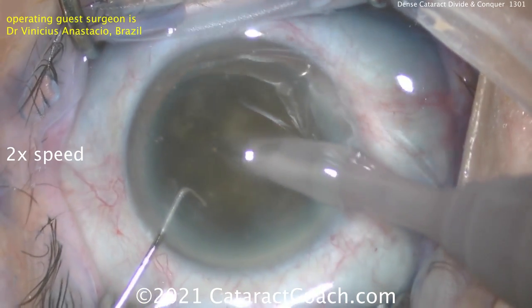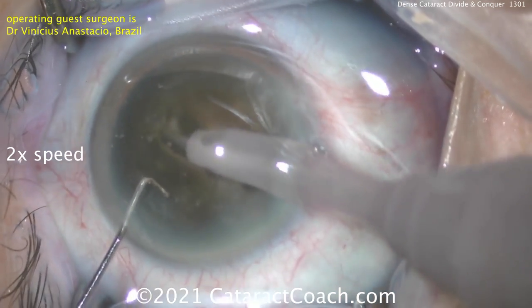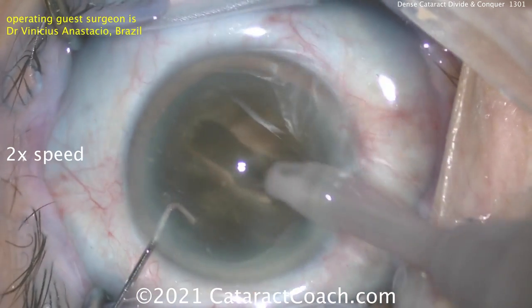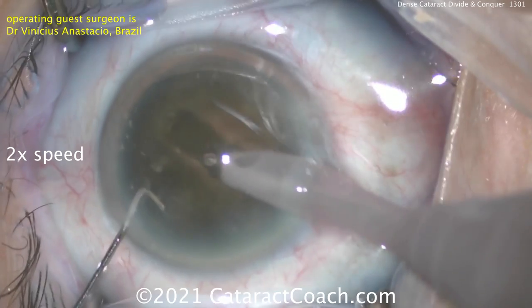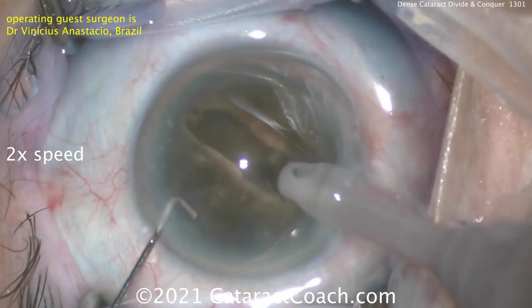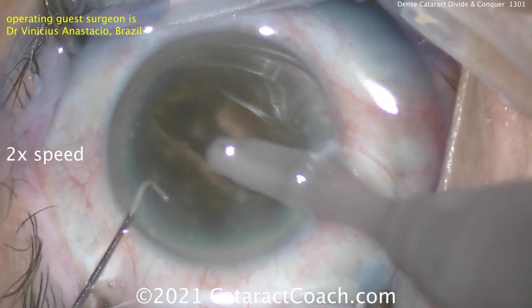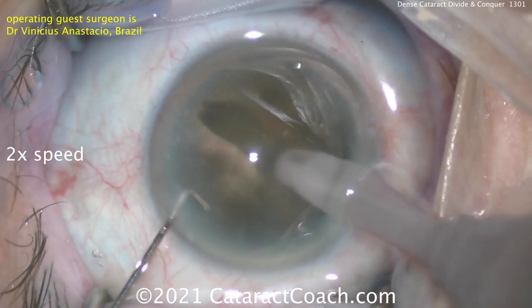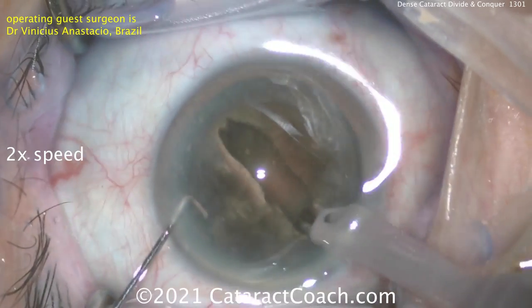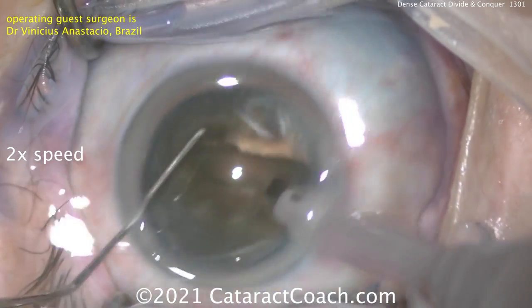A couple of important things: you're going to use a lot of energy to make the grooves. Look how nicely the phaco needle stays centered in the incision — you need to do that. If you ride the sides of the roof of the incision, you're going to cause a wound burn. Dr. Anastasio is an expert here, doing a beautiful job of keeping that probe floating and pivoting in the incision. There's the nucleus grooved once — that looks great.